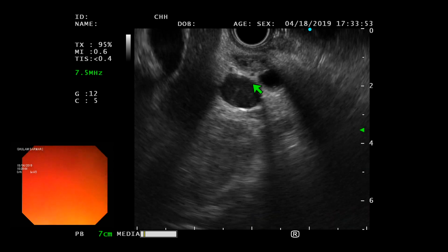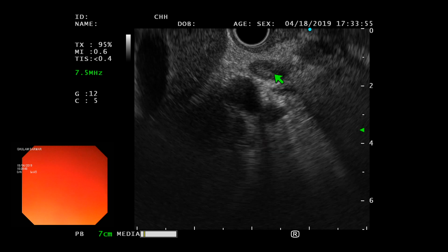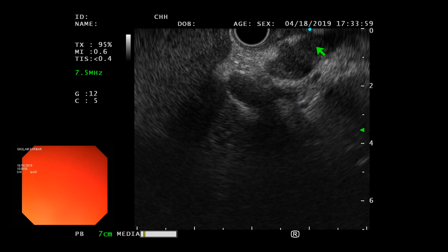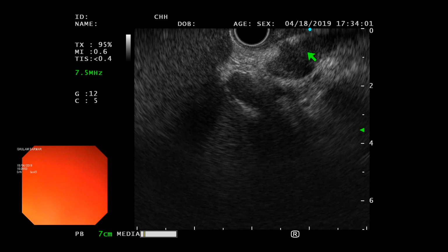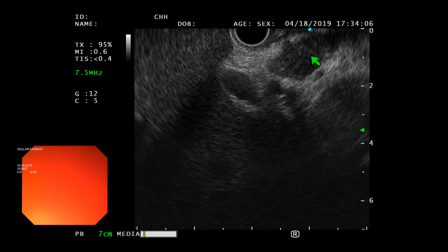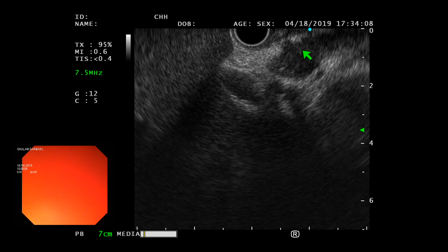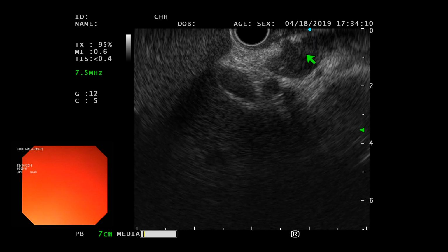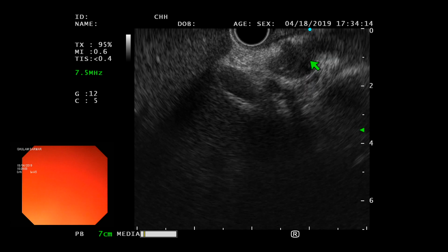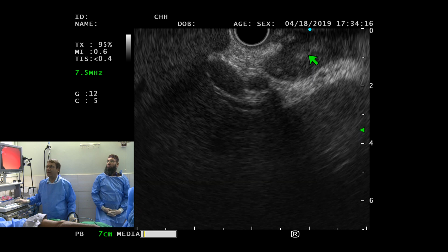Again, this is a very bothersome area. I just don't like the way it looks right here. That's the neck of the gallbladder. You guys can appreciate that, right? Here, it looks like a mass. It's not a sludge. Well, it's definitely a mass. It can be an inflammatory mass. It may be a neoplastic mass. Absolutely, that's a point well taken. It could be inflammatory. It could be a real mass.